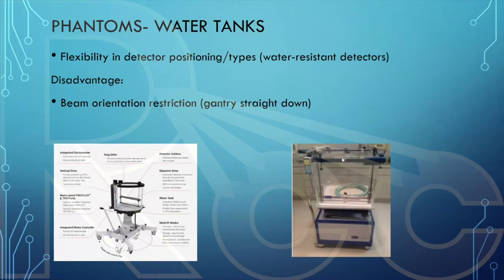So here is the opening of the tanks, meaning that you don't have walls. So the beam will have to come from this direction to do your measurements. There are some water tanks that are vendor driven, meaning that you cannot use a different vendor's detectors in a specific water tank.